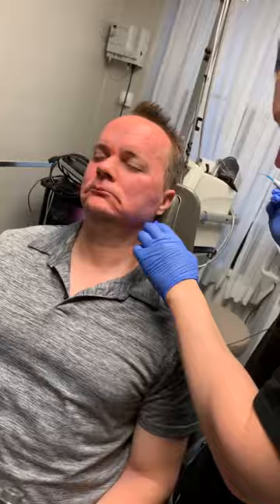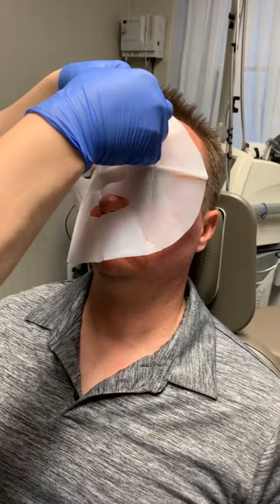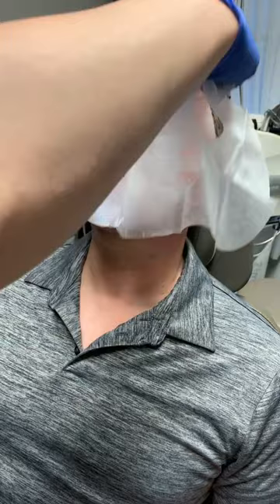We've got all those problem areas now. Before we put on the cooling mask — let's show that — this will help him heal much more nicely. It will cool down his skin, plus it has other active ingredients to help his skin heal. That's the key.